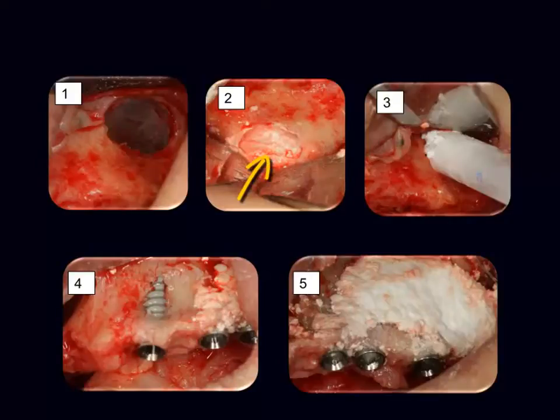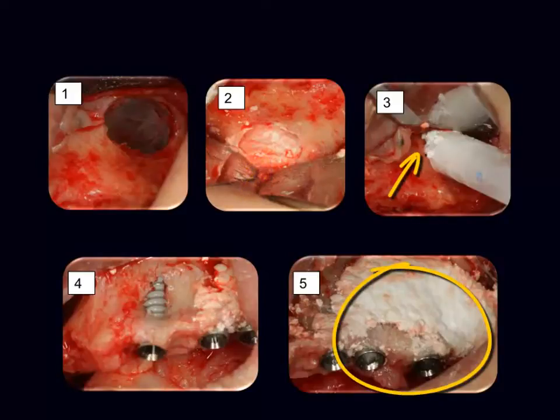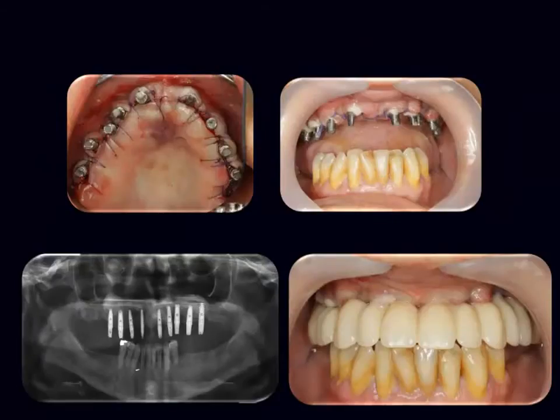During the sinus cavity augmentation, it is recommended to elevate the sinus lining and then use BONDBOND alone as the first layer above the lining. Then use BONDBOND as a composite graft, applying the next layers until the entire sinus is augmented. Immediate loading with provisionalization. Using BONDBOND both as an augmentation material and as a barrier simultaneously enables implant placement, augmentation, and immediate loading by provisionalization.